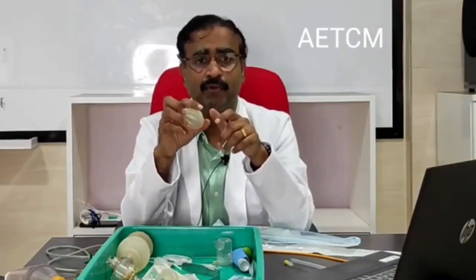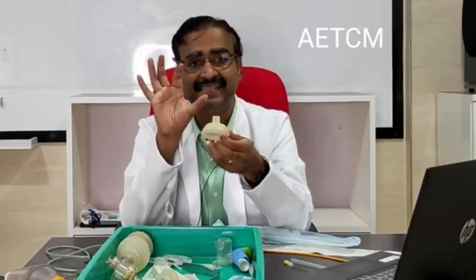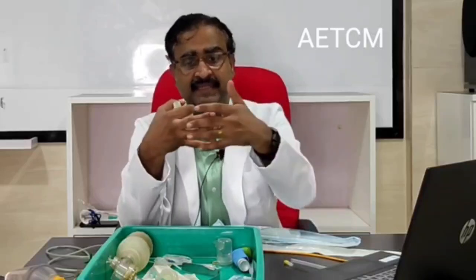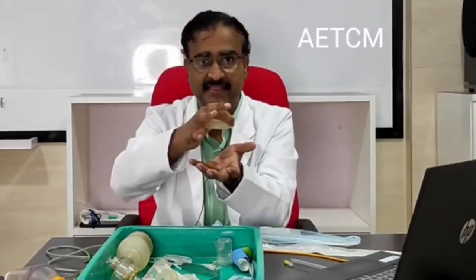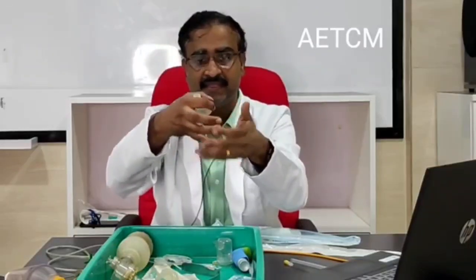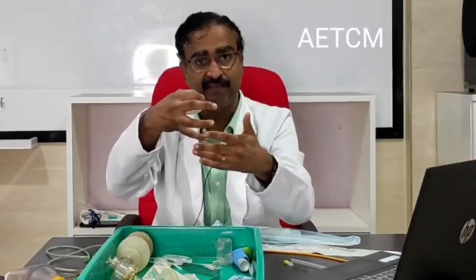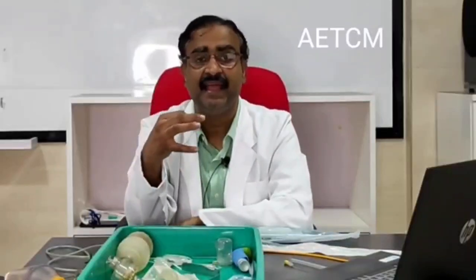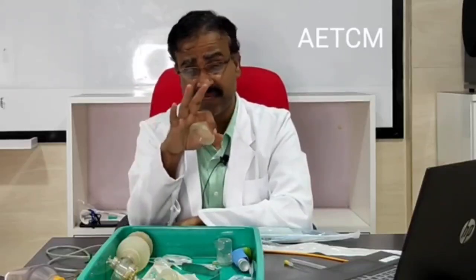Okay, how do you hold this? You keep a C-shaped clamp on the mask from above, and then these three fingers are kept in an E shape, alphabet E, on the chin, so that the clamp is kept on the face, with a mild head tilt upwards in such a way that the airway is kept straight and patent. You thus ensure that the baby gets a continuous airflow and your resuscitation is an absolute success.